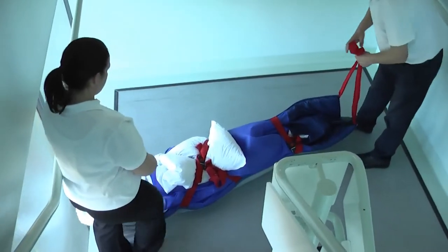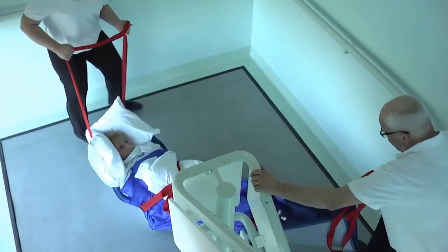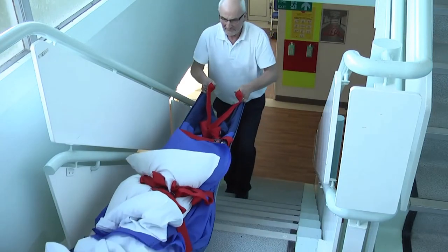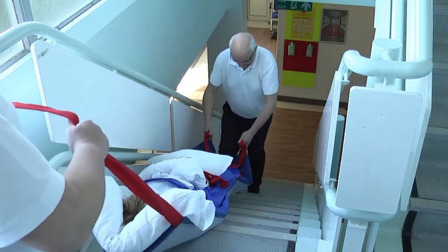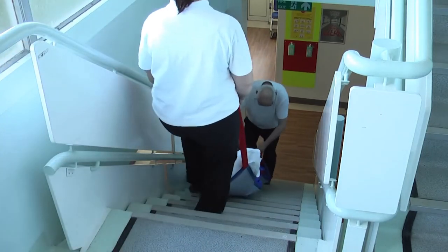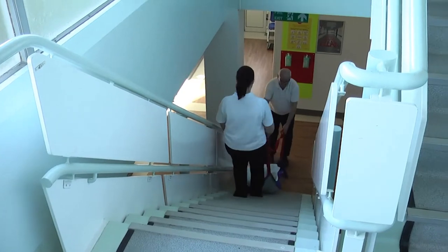When reaching the half landing, it's important to steer a wide course so you don't encounter problems with the central pillar of the staircase. If needed, the straps can be used to position the ski slide pad. The foot end operator controls the speed of descent. Communication is fundamental to ensure the head end operator does not overbalance in an attempt to keep up.